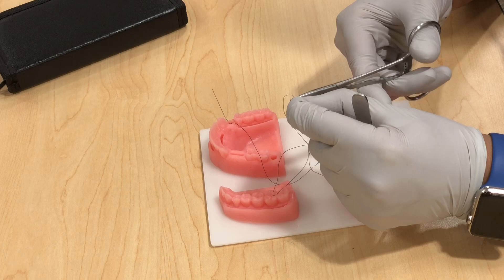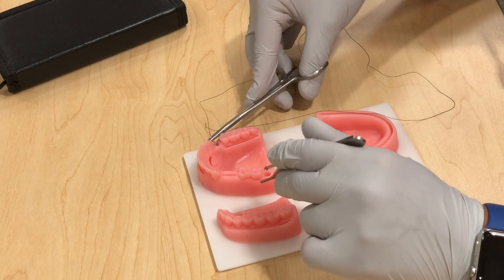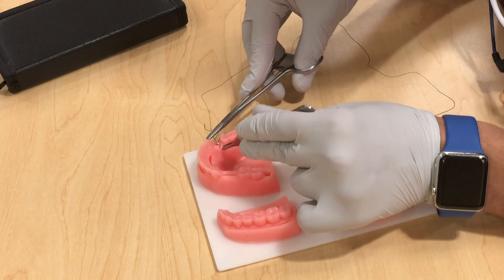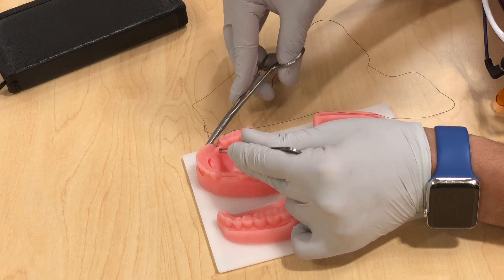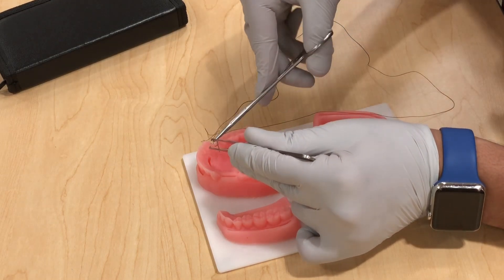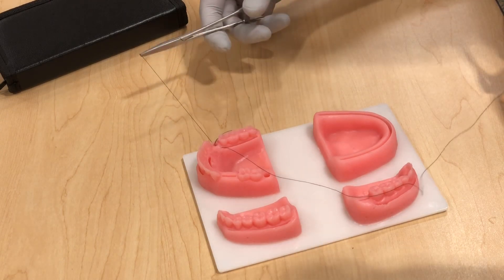Go again at almost 90 degrees to the incision or flap. Hold the soft tissue with the tissue forceps to keep it still. Ideally, make it symmetrical to the other side — if you entered 1.5 to 2 millimeters from the incision, you want to mimic that on the other side.